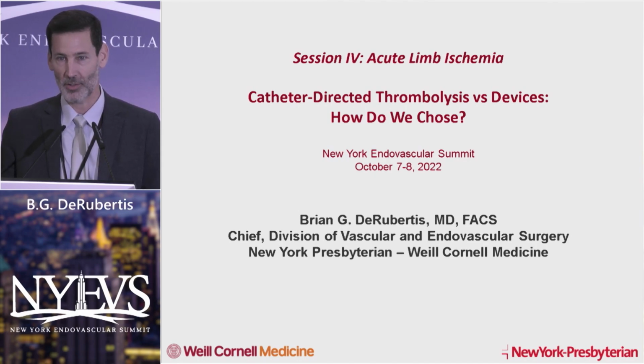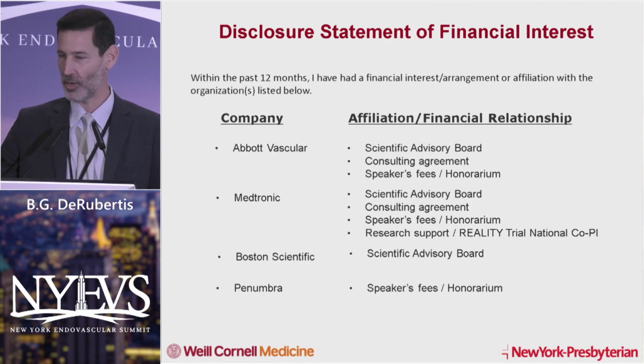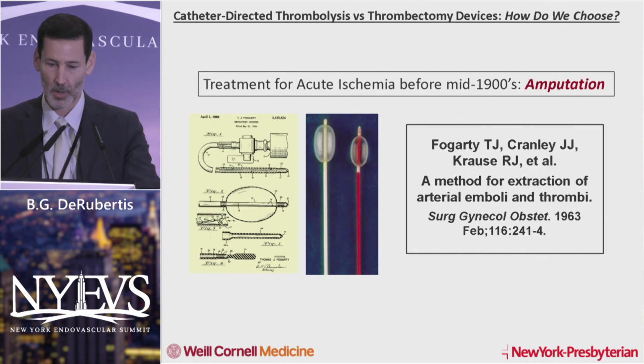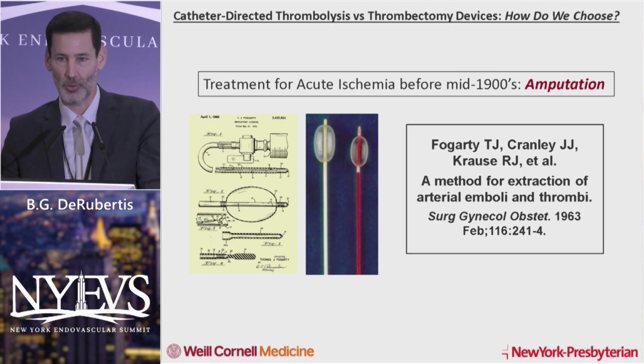In other cases where you have extensive thrombosis, in situ disease, there's no easy way to fix those. And so I think that the patient heterogeneity is important, and deciding which approach to use isn't a binary thing. It's more of reaching into that toolkit and applying different techniques for different patients and also different points along a specific patient's care.